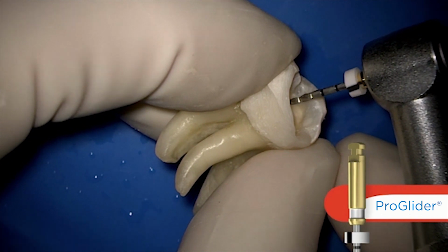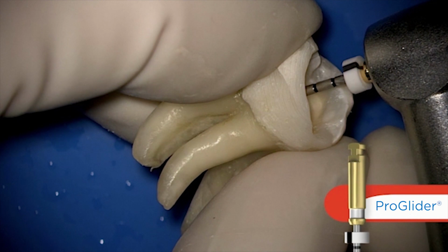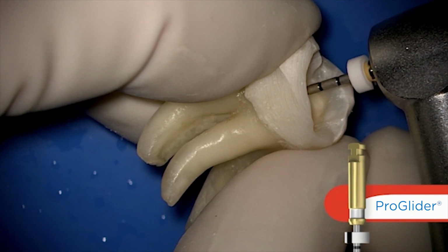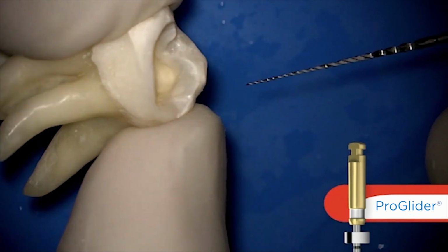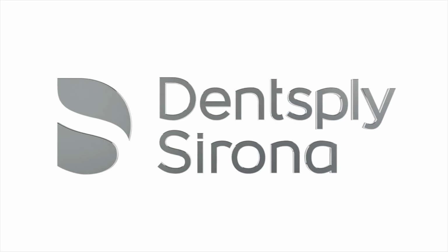Notice all that mud. In the lateral view, watch the instrument easily progress along the glide path of where the 10 file was. Remember, in glide path management, we want a smooth, reproducible glide path, and we call that a secured canal, and ProGlider can expand that canal so that easily the shaping files can follow.